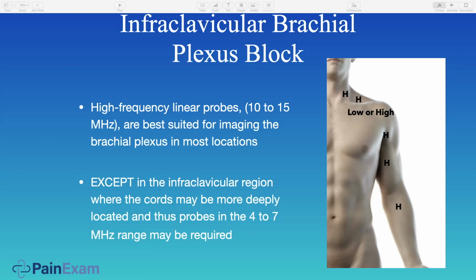But for those of you who have the option to have a high or a low frequency probe, I generally recommend a high frequency probe for almost everything I've mentioned today, except for possibly the infraclavicular brachial plexus. And that could change depending on the patient, meaning if it's a larger patient, use the lower frequency probe for greater depth penetration. The other advantage to the low frequency probe is it's curved, so you actually can have more room for the needle to go between your clavicle and the probe, whereas with the flat tipped high frequency probe, it may be more difficult.